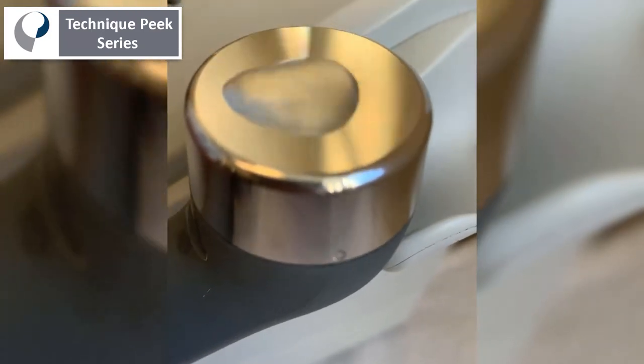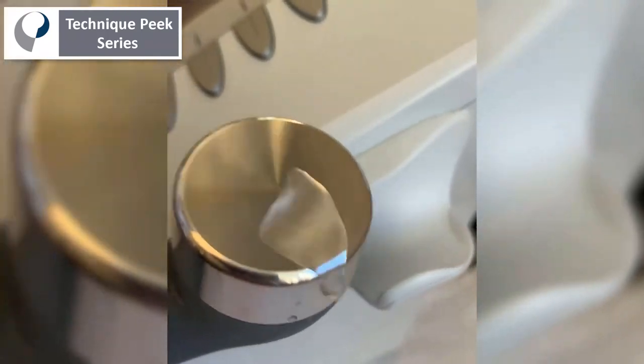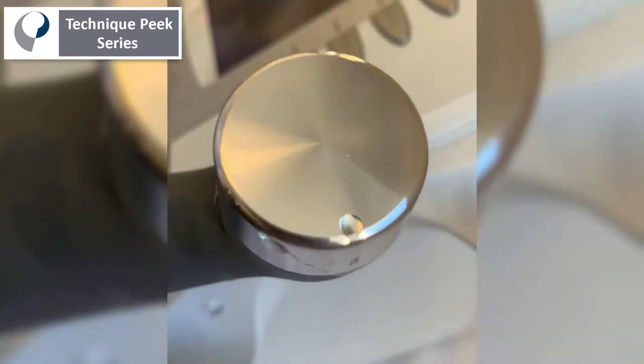That would be one quick way to test if the transducer head is working. Another way is the light is on, but that may not necessarily mean the crystal's working. So that's a quick way to check.